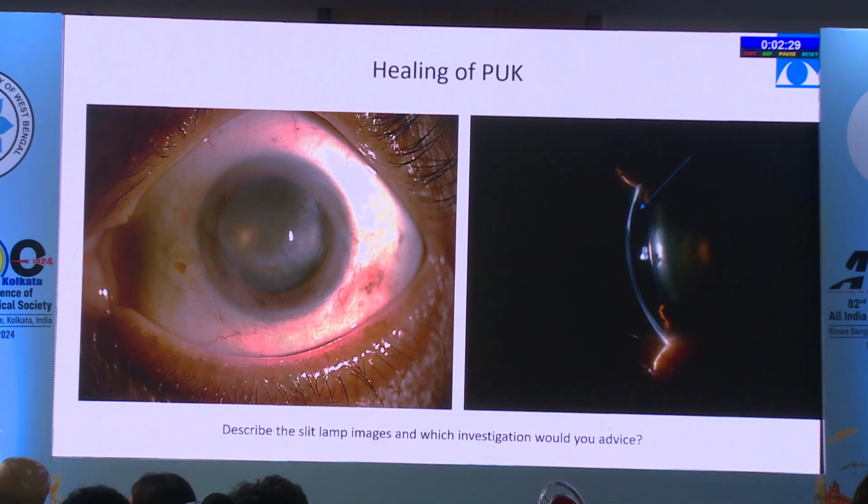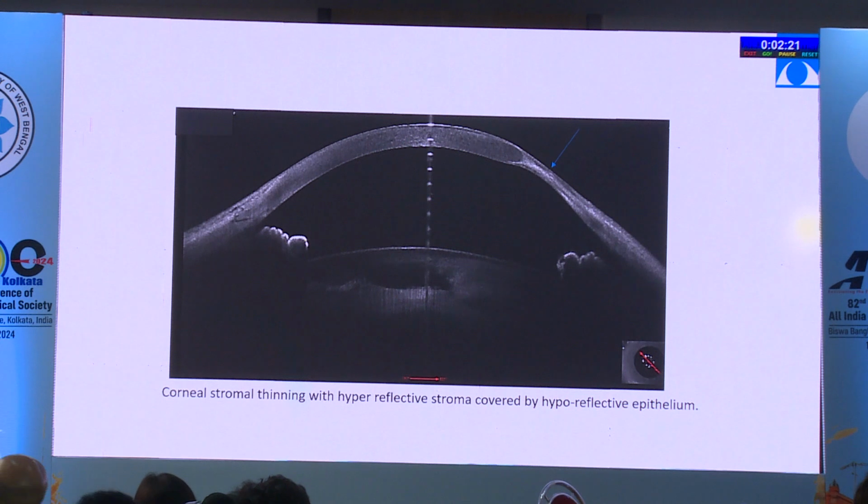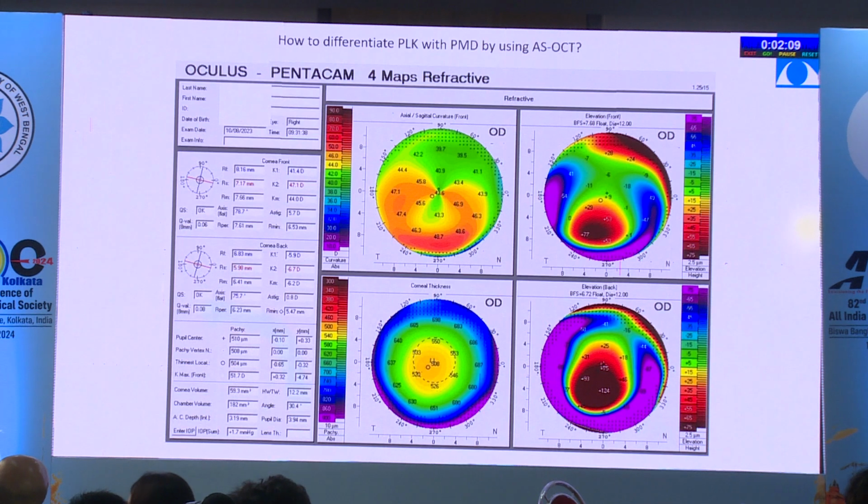And this is a patient with peripheral ulcerative keratitis. You can see extensive thinning in the periphery. So do you want to jump in and give immunosuppression to this patient? If you take a minute to see the MS39 picture, the area of thinning is wafer thin, but it is very well epithelialized. Again, the disease process is quietened over here. You don't need to immunomodulate this patient unless there is a recurrence of activity.